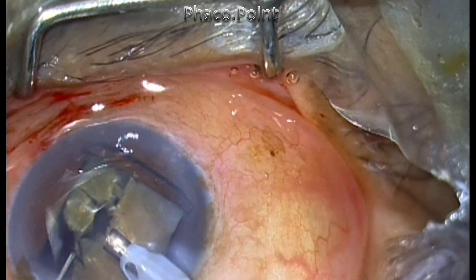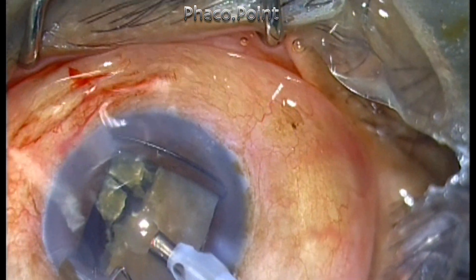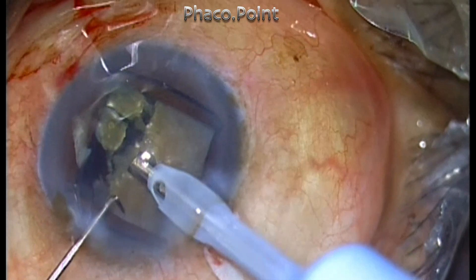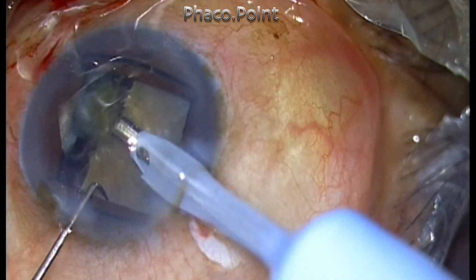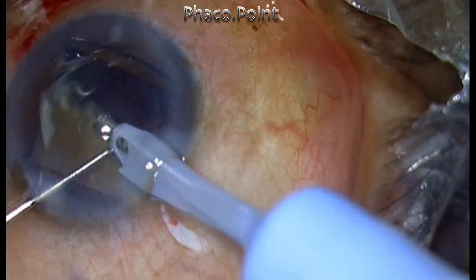It's a very important point to stress: before you mobilize the pieces, make sure the piece is completely free. Otherwise, it will tag on the entire nucleus and you will have a tumbling of the nucleus, which would be very detrimental to the nucleus disassembly procedure.